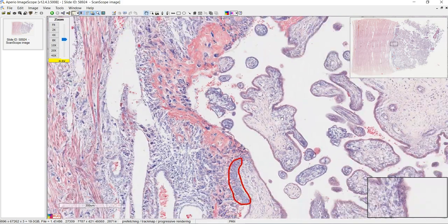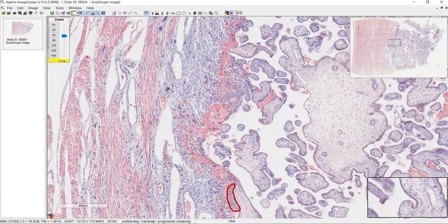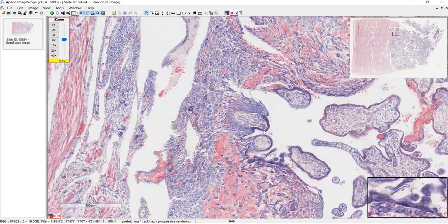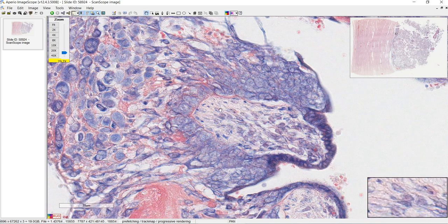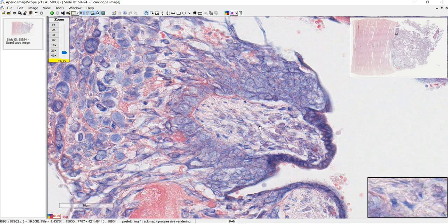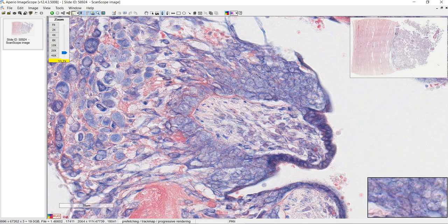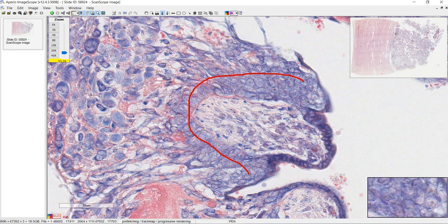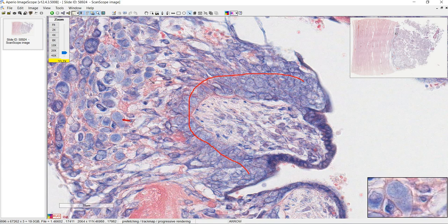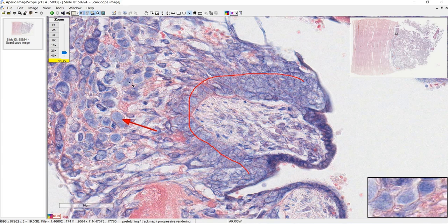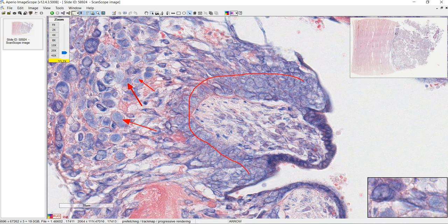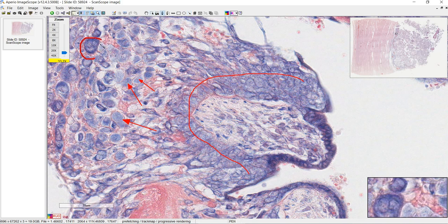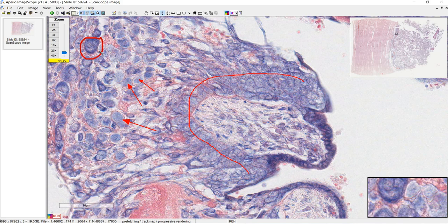Here's another example — a stem villus that's anchoring, and this blue area around it is the cell column. We also see some decidual cells. This one over here has three nuclei — that could be a fetal giant cell.